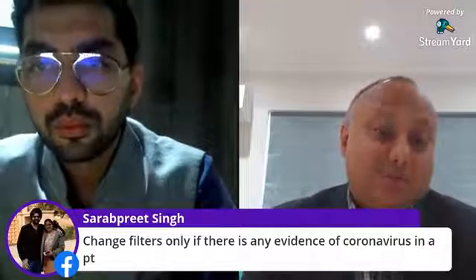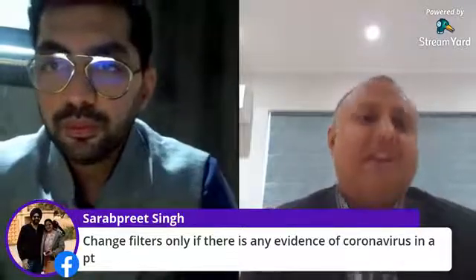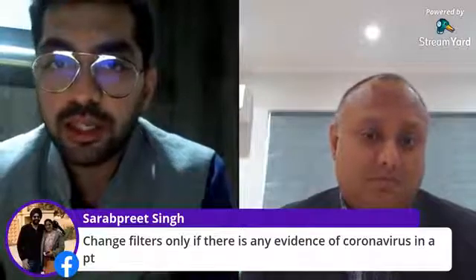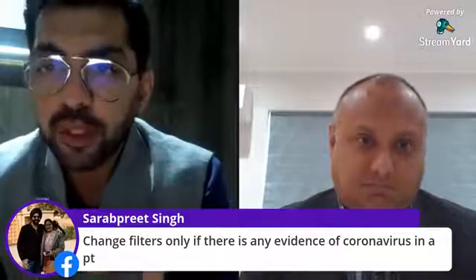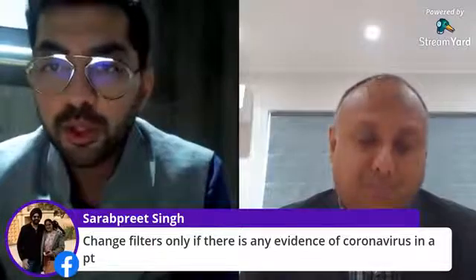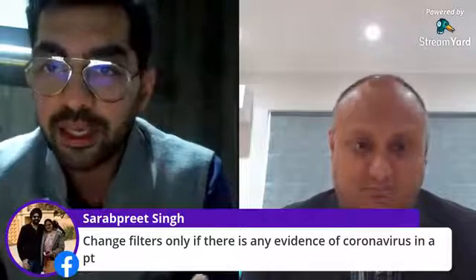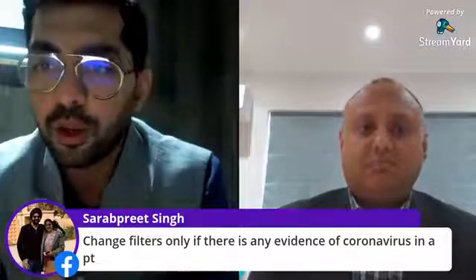Don't forget, even when you're disinfecting, you want to make sure that all the VOCs and everything are released out of the system. 2 weeks is needed because once the lab is shut for so long, especially in India, a lot of people are doing batch IVF or accumulating cases and doing them on a particular day, so the labs usually are shut. In those cases, VOCs do get accumulated, and that's why we have to give the lab a little bit of time to get back to the best of its health, and then only start doing cases. So that's, I think, one very important point that all of us have to consider.